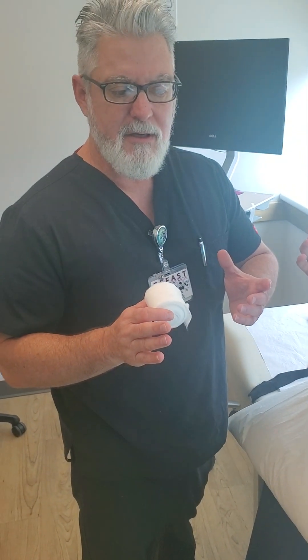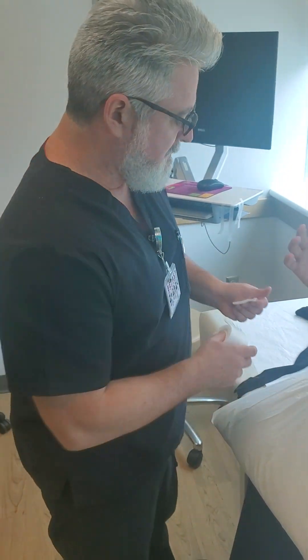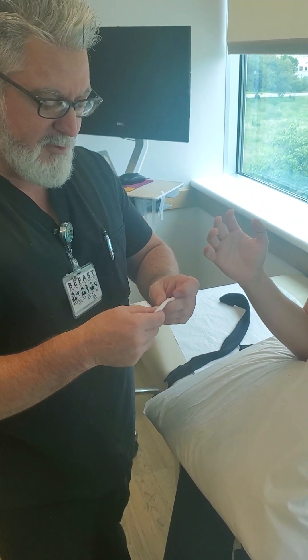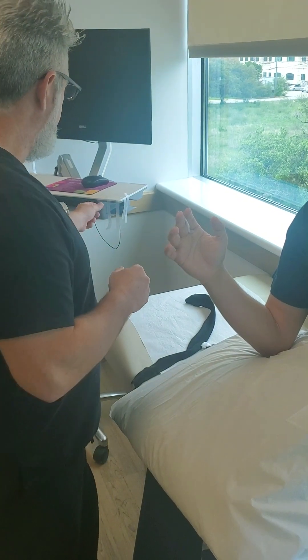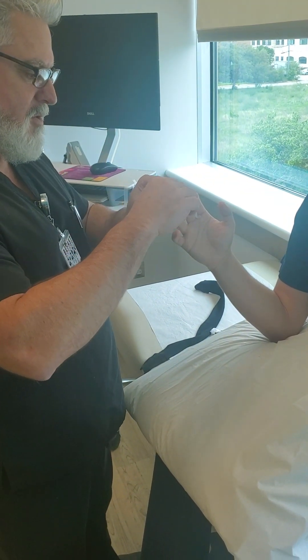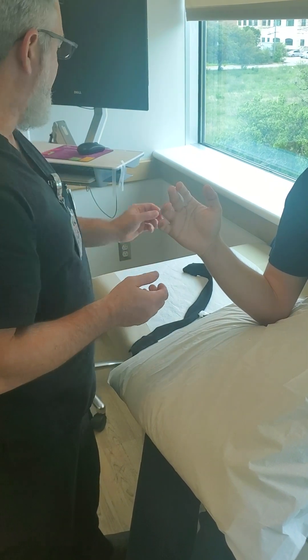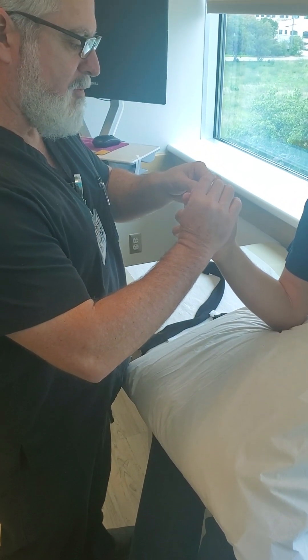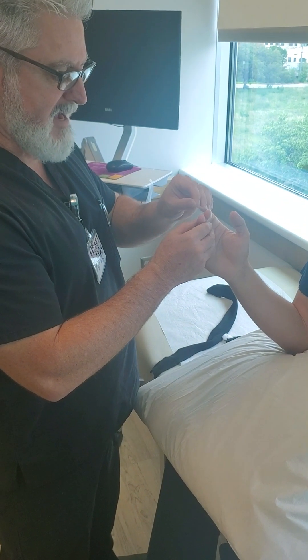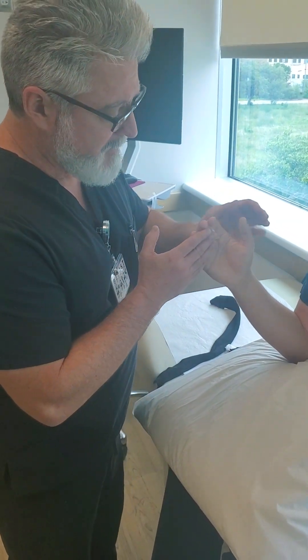We're going to start, just like we do with the ulnar gutter and cobra cast, by putting cotton in between the fingers and securing it with tape. You take a couple little strips of cotton, fold them over a few times, and place them in between the fingers. Make sure your tape is long enough to go all the way around the fingers and stick to itself. The tape never has to be tight — it's just to hold the cotton in place. The whole idea with the cotton is to keep that macerated buildup between the fingers to a minimum.